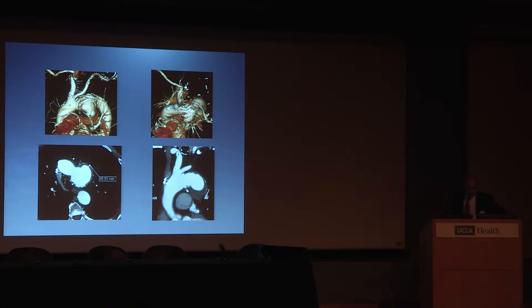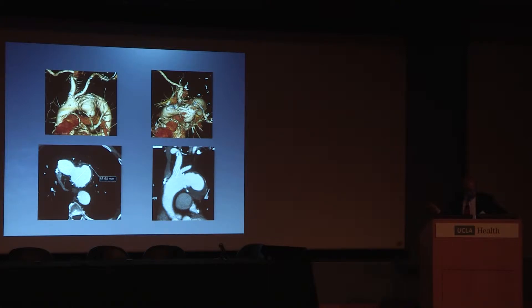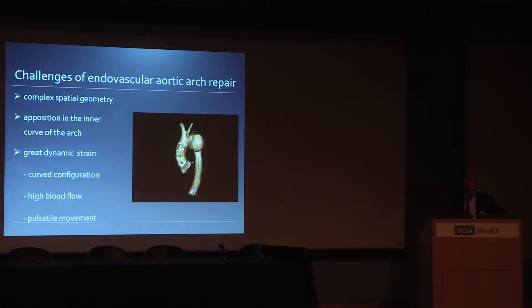A classic patient who might be offered this kind of technique is one who's had previous coronary artery bypass surgery, has significant comorbidities, and has an isolated arch aneurysm. We'll find out what happened with this patient later in the presentation.